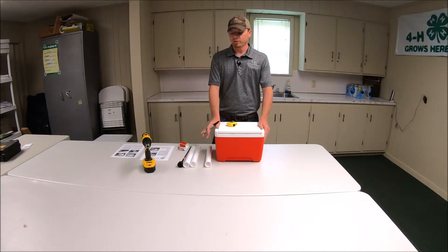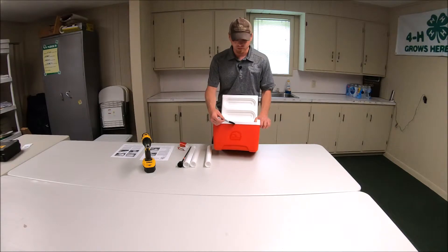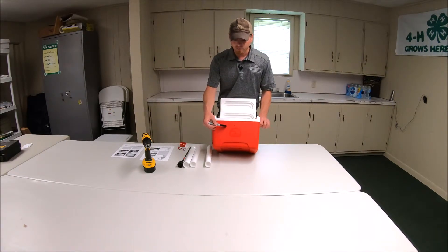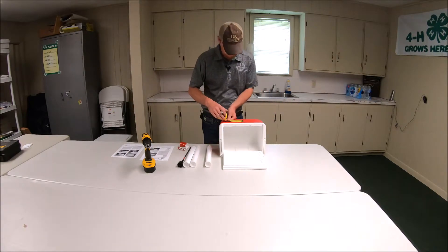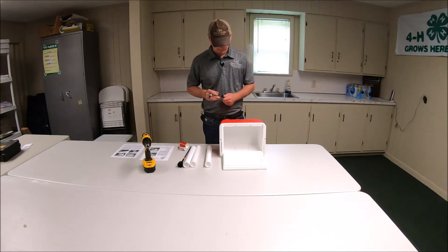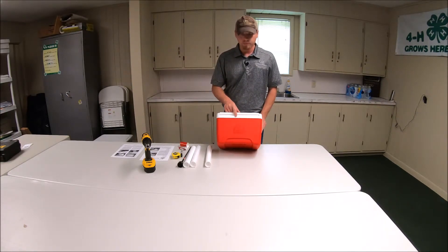Now that we have all our tools and supplies, we need to start measuring for the holes to drill in the side of the cooler. First, find the center of the cooler. I've already made a mark here for the center and measured two inches down from the top of the cooler with the lid up. Now I'm going to measure two and three-quarter inches on either side of this center mark. There we are — we have our three marks made on the cooler where we'll drill our holes for the syringe holsters.